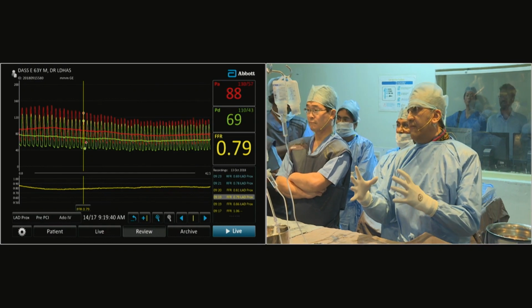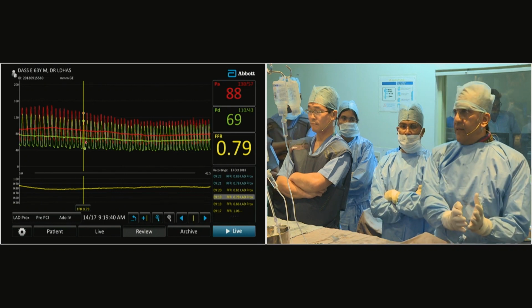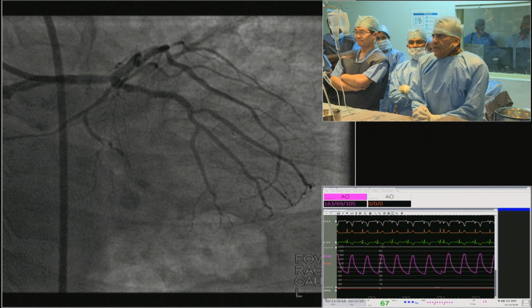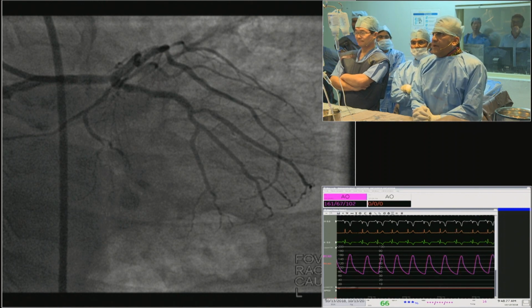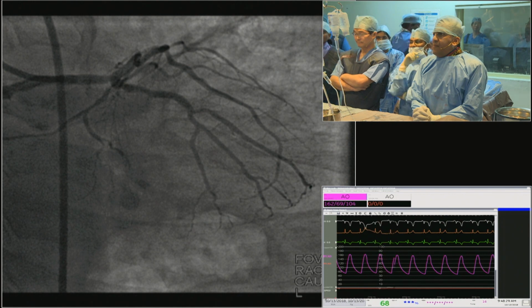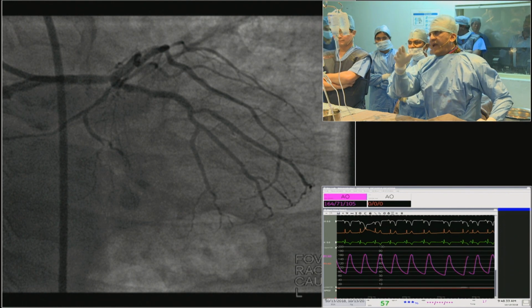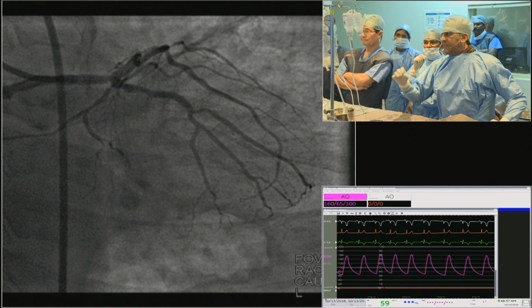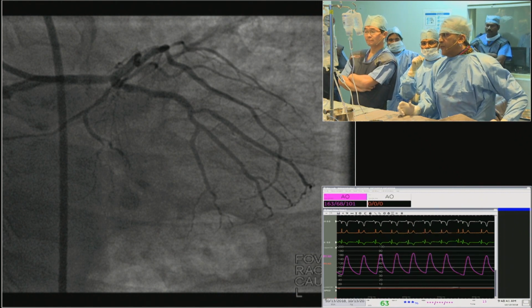So most of you believe that we should put an imaging catheter into the LAD and take a pullback, right? And the circumflex as well, please. Yeah, that's provocative and sure. I would love to do that. But my question is that in these kind of angulated lesions, you put in an IVUS catheter, and if I raise a plaque and make it hazy, then I'm pushed into treating it.